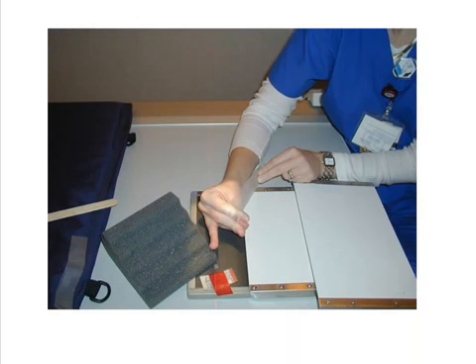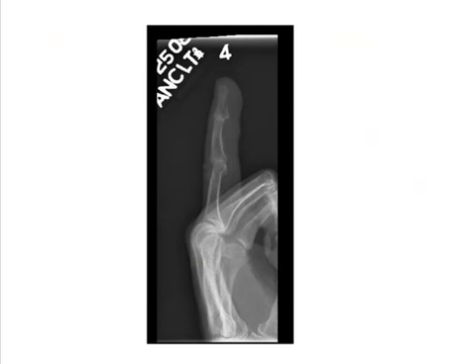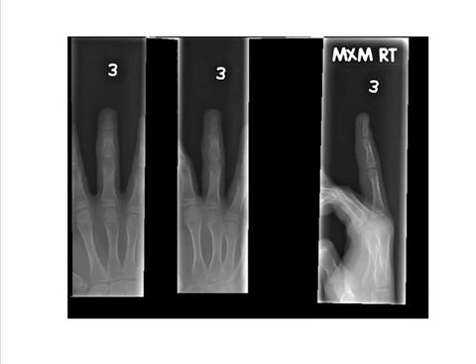Collimation improves radiographic contrast. The central ray is directed to the proximal interphalangeal joint. The lateral digit radiograph should demonstrate the entire digit with unilateral concave anterior surface of the phalanx and the fingernail in profile. Appropriate contrast density will demonstrate both soft tissue and trabecular detail of the bone.